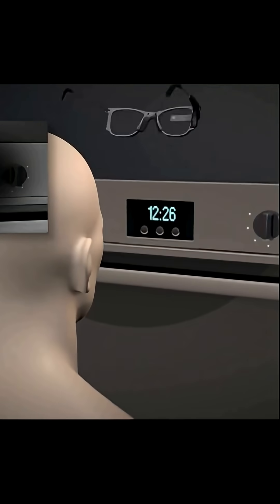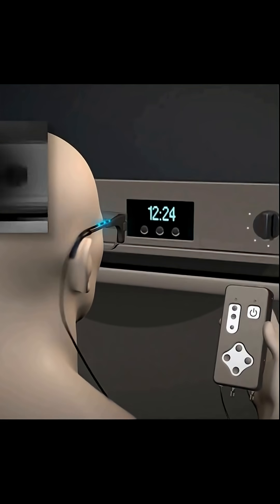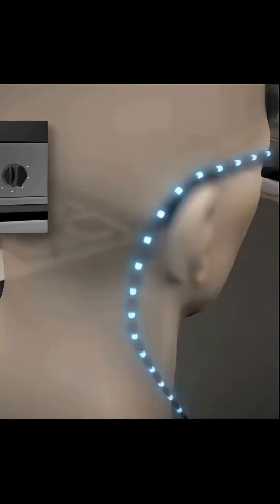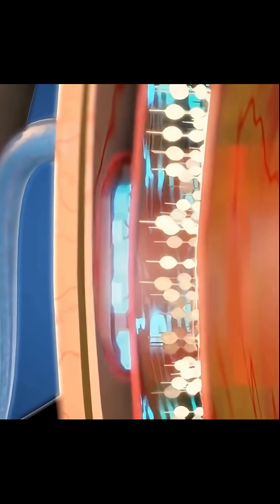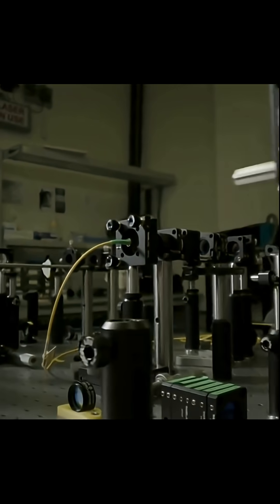It's difficult to read without central vision, so a pair of glasses with an embedded camera captures visual information from the environment, which is transmitted into the eye via near-infrared light. The implant accepts this light and stimulates the retina in the same pattern.